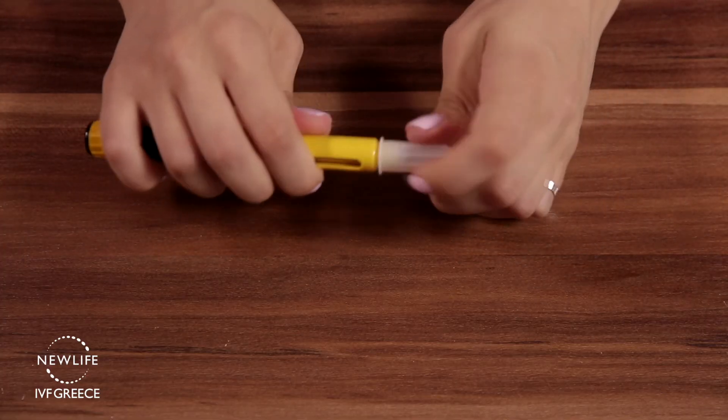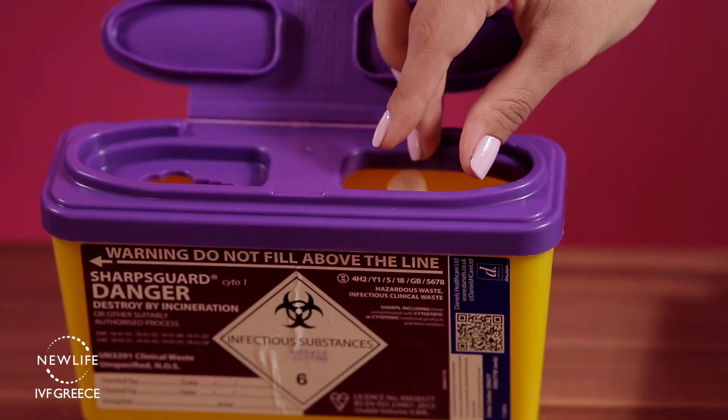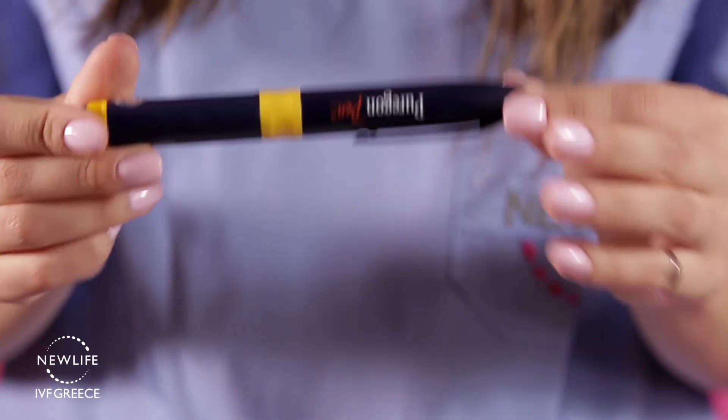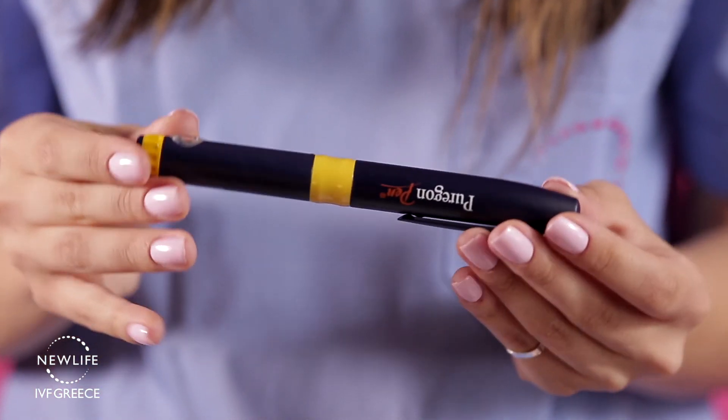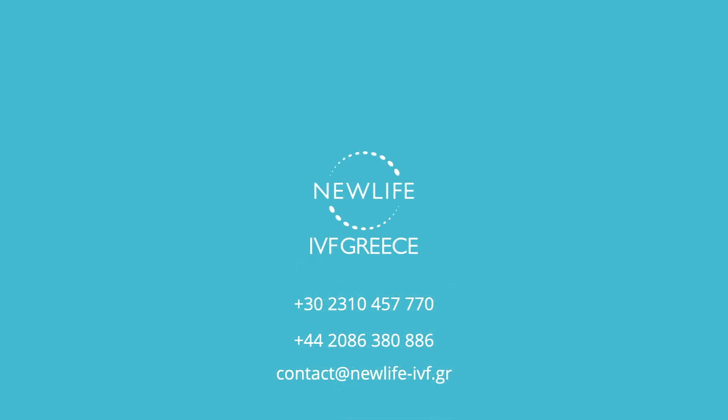Carefully put the outer needle cap back onto the needle, unscrew the needle, and dispose of it in a suitable container or bring it to your nearest medical facility. Remember to place your Puragon pen containing your medication back into the fridge. If you have any further questions, please feel free to contact our IVF unit.